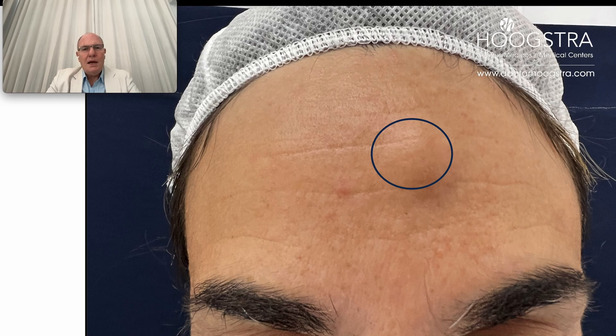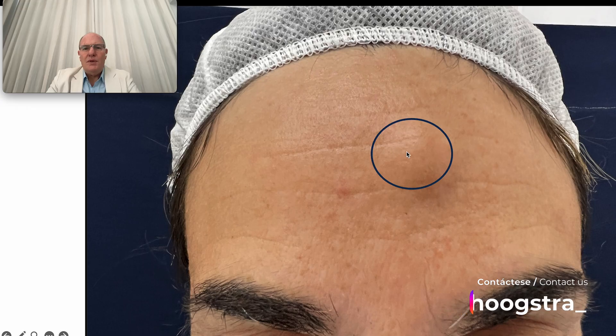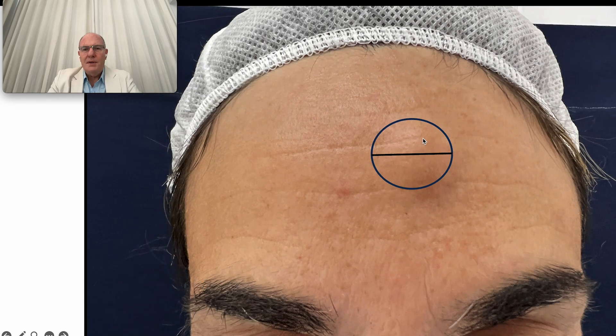I'm going to show how it is possible to remove big tumors of the frontal area with a minimal incision. This patient comes from outside of my country because in her city many plastic surgeons said that this lesion could only be removed through an excision from here to here, like this.